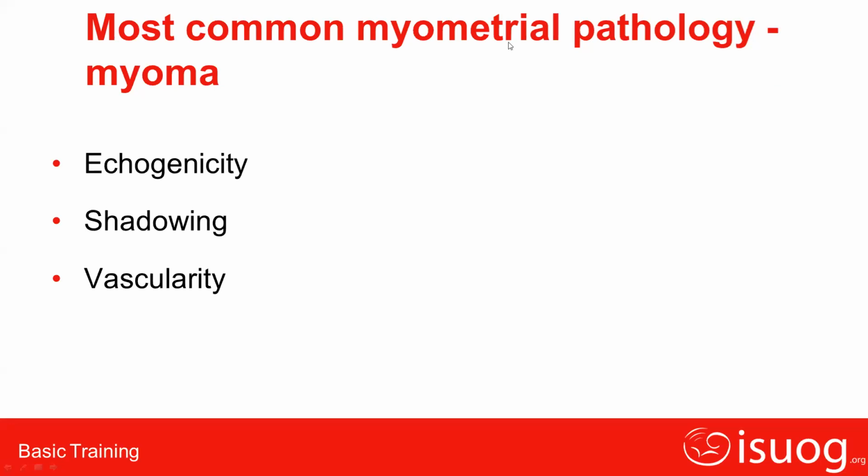So sometimes when there are multiple myomas and the gynecologist surgeon sends you for the images, you have to show in a diagram also how to do fibroid mapping. In the fibroid mapping, you have to first draw a diagram of the uterus.